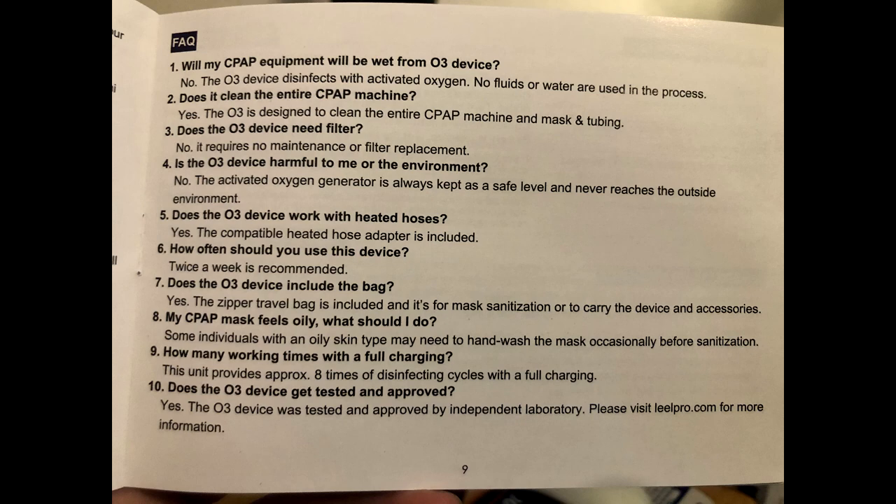I don't know how long it lasts on one charge. According to the instructions, on a full charge you have the ability to disinfect up to eight times. It doesn't specify whether that's the 30-minute or the 20-minute cycle — I'm assuming it's the 30-minute, but I don't know for sure.